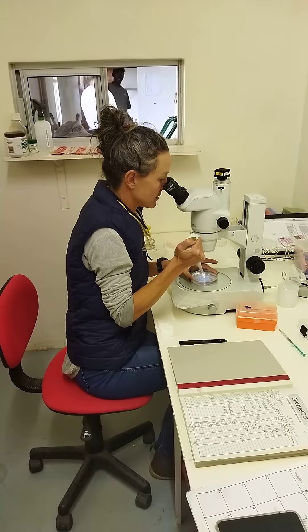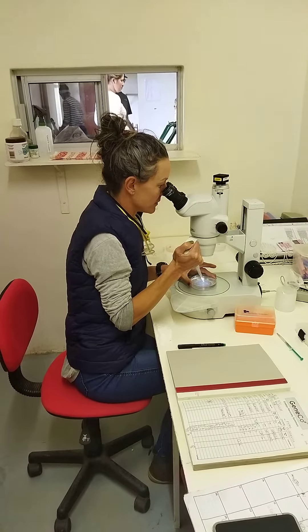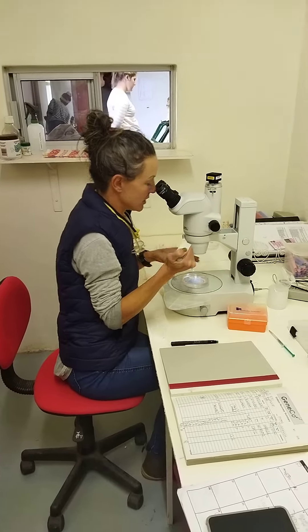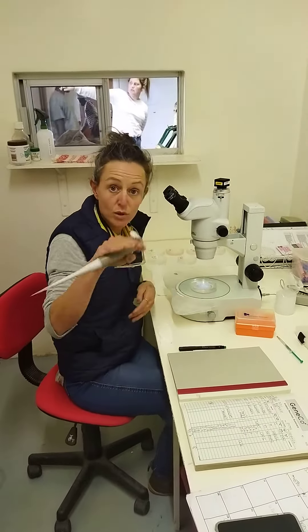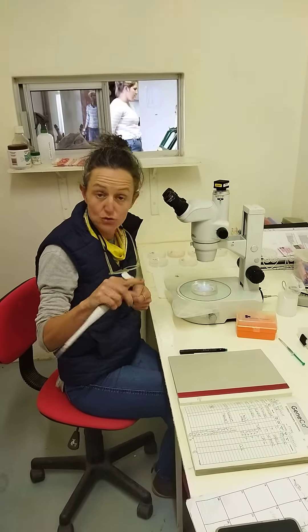Once we find them, I just spot them and pick them up with my pipette. Then they go straight into the holding media, which has been warmed up a little bit so they're still at the same temperature.